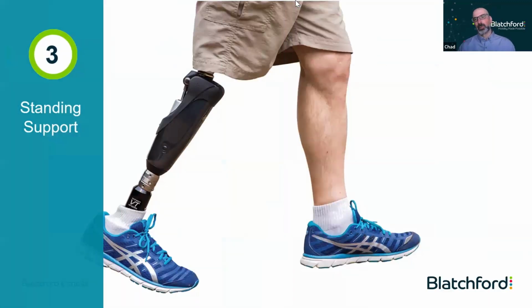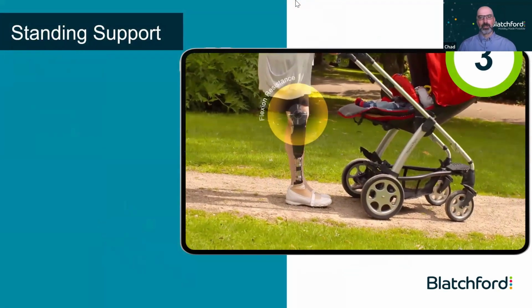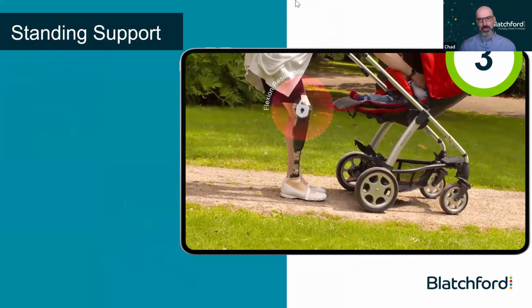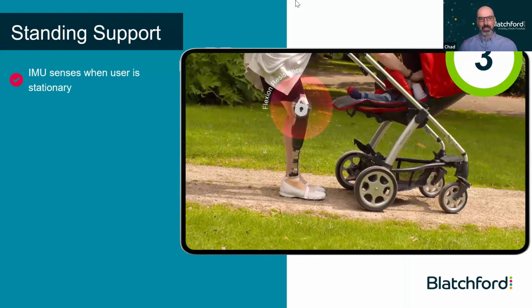And standing support. Lastly, most people are familiar with standing support. What the Orion does is it's going to give that standing support in a flexed position or also in full extension. So you can see in this video, she's got her knee slightly flexed and it increases and locks in that position. But in a full extension position, it will also lock. The reason there is, think about if you're standing on a slope with a fixed ankle, and if you're facing downward, that knee's going to want to just buckle all the time.